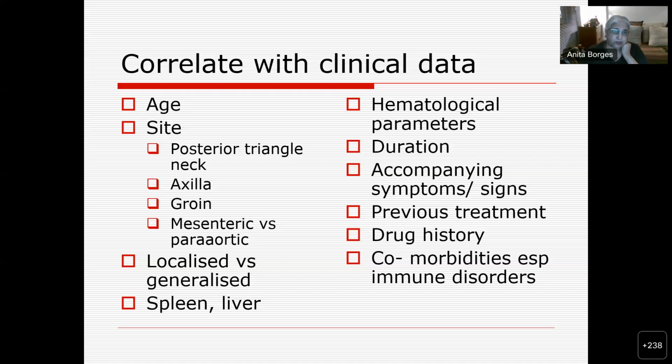avoid these pitfalls. Now, I'm going to spend a little time on the site. I get requisitions all the time, and I'm sure that you do. This is a cervical lymph node, all right? Now, to me, I never accept that, because the neck is a whole big area. You have the lymph nodes.